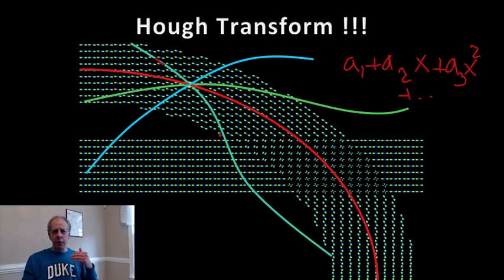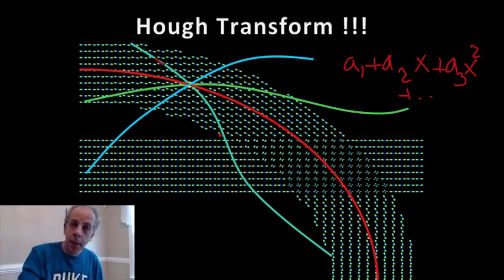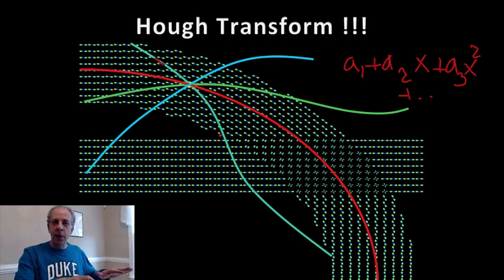When we talked about the Hough transform, we were kind of adding the edge content. If there is an edge, we were voting for it. If there wasn't, we weren't voting for it. Here we actually do a weighted voting. We vote by the probability of going in that direction. But it's the Hough transform. This is, I think, very beautiful, that we can use a very standard theory for a very cool application in a modern image acquisition technology.